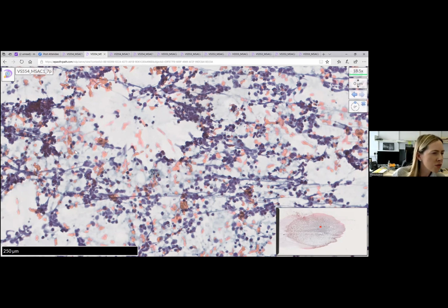I think I saw a differential of a high-grade lymphoma. So this can be in the differential, but then I usually have a checklist of why it wouldn't be a high-grade lymphoma. So the first instance is with a high-grade lymphoma, the cells are actually larger than the small cells. So I often use the red blood cells as a comparison. So in a high-grade lymphoma, you'd expect them to be at least 2 sizes or 3 sizes larger than the red blood cell. They tend to have more cytoplasm than the small cell carcinomas.